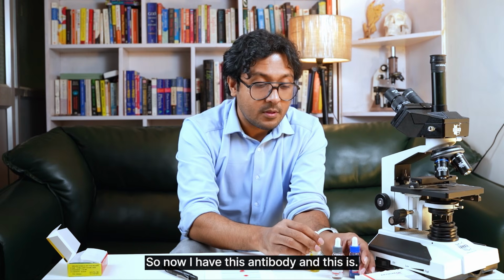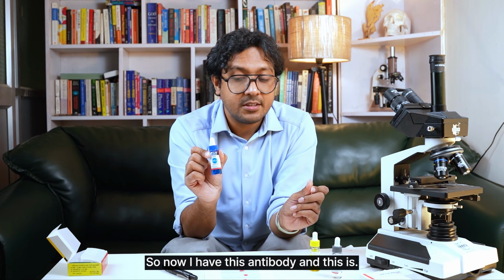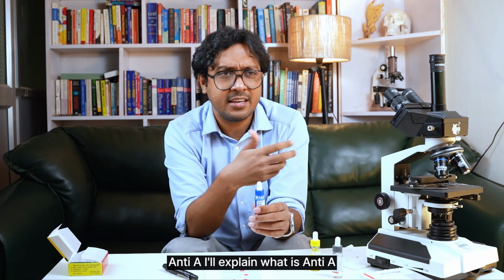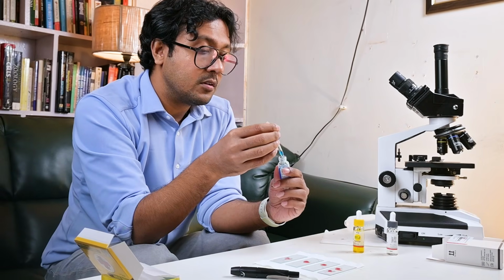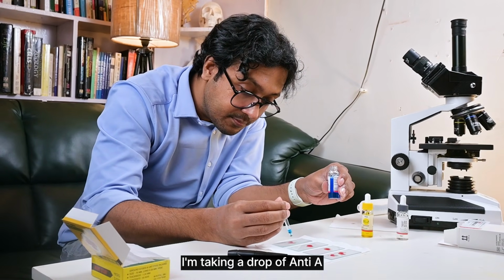So now I have these antibodies, and this is anti-A. I'll explain what it is. Now here I'm taking a drop of anti-A.